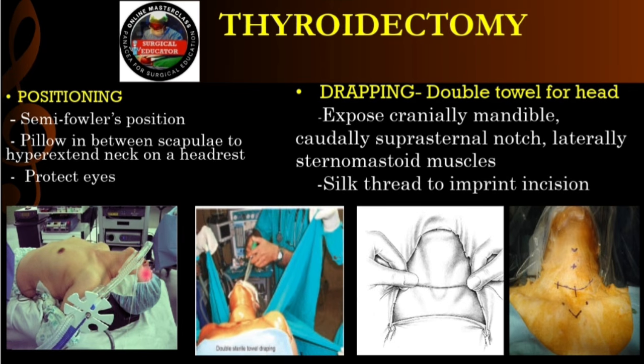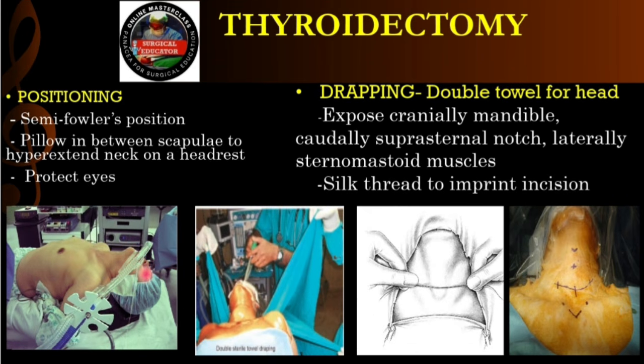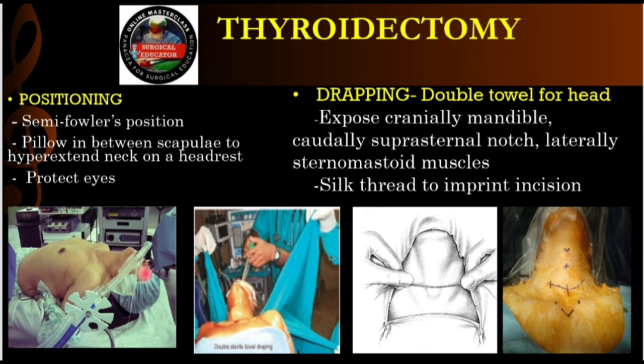Now, there's one tiny detail here before prepping the skin that I found fascinating. Protecting the eyes. A meticulous surgeon leaves absolutely nothing to chance. Because under general anesthesia, the patient loses their blink reflex, right? Completely abolished. The eyes naturally rest slightly open.